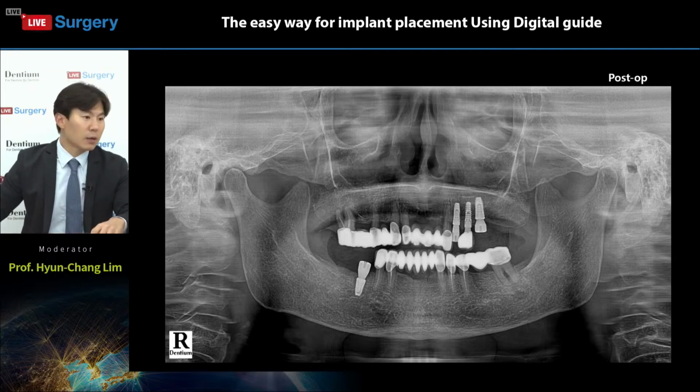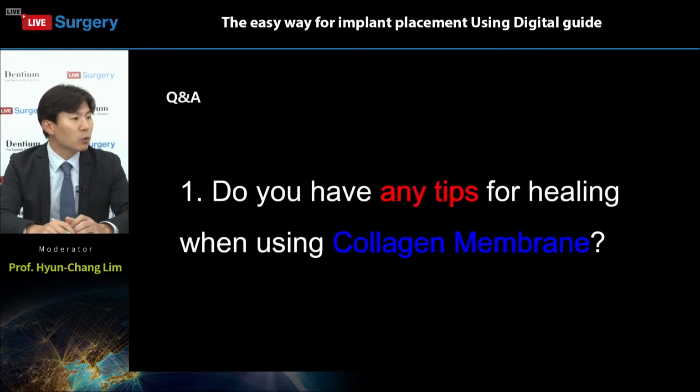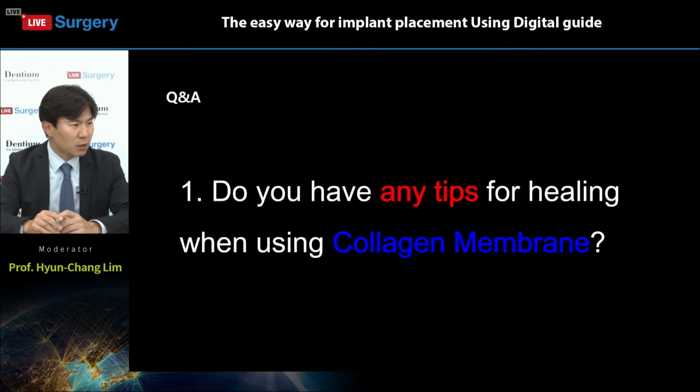And let's take a look at today's question. We have only one question. The question is, do you have any tips for healing when using collagen membrane? The question is a bit confusing, but as far as I understand, I think the questioner asked about the type of healing for the GBR.